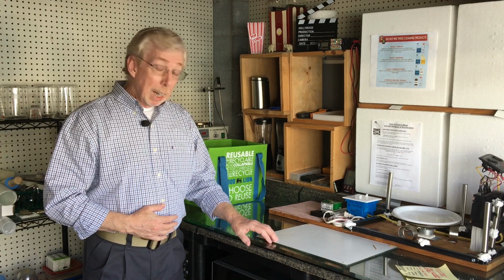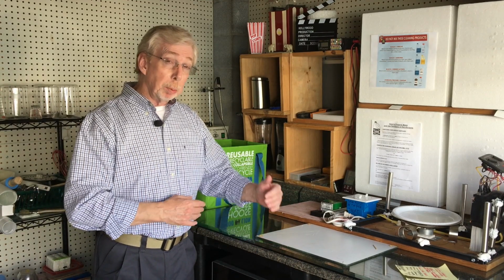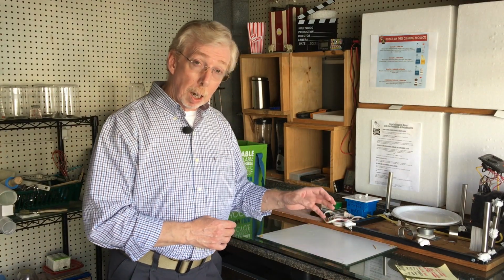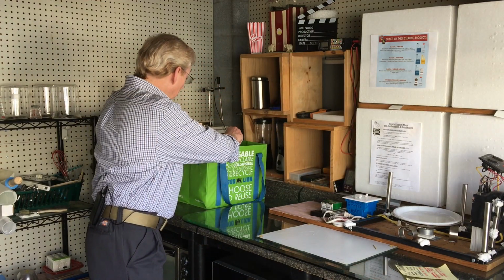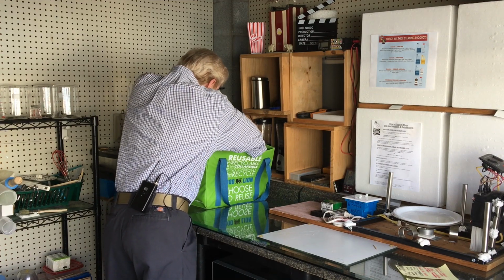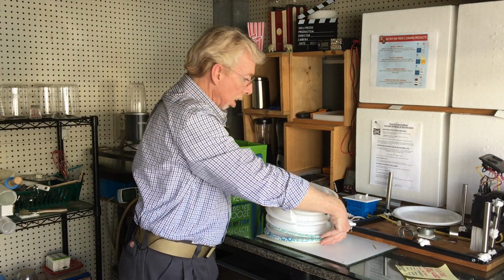All right, so let's see where we're at. What I've done is made several adjustments to the chemistry, specifically the glycerin. And I've produced several different types of products by just that one simple adjustment. So this is the latest one here. I've been busy, and I'm going to show you what I've got here so far.